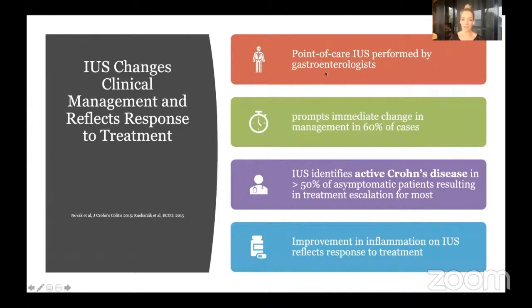So point of care intestinal ultrasound can be performed by gastroenterologists. It has been found to prompt immediate change in the management in 60% of cases. So this is a game changer. It identifies active Crohn's disease in greater than 50% of asymptomatic patients, which results in treatment escalation in most of those patients. So as I said, it really pushes that treat to target therapeutic algorithm. And what we do know is improvement in inflammation on intestinal ultrasound reflects response to treatment. So if you do that ultrasound at 3 months after treatment and they've responded well on ultrasound, you generally know they're going to do well longer term.